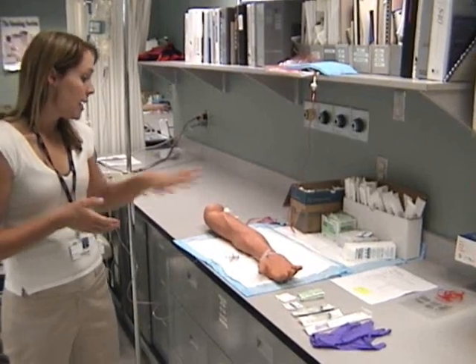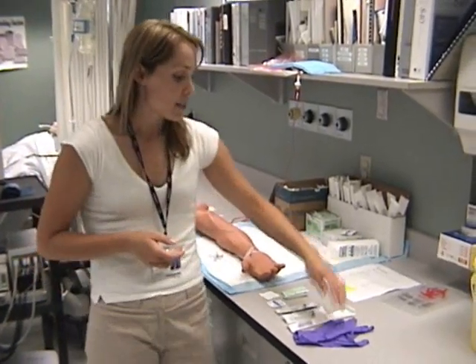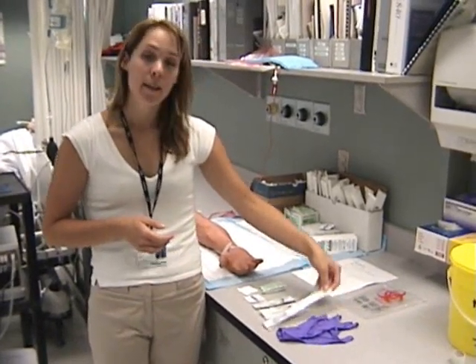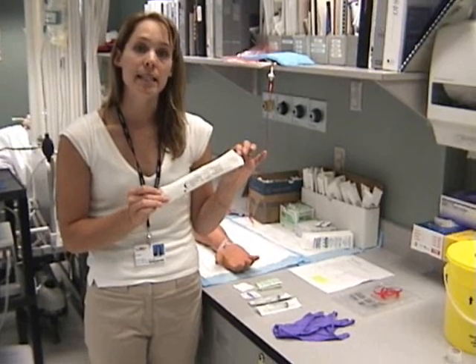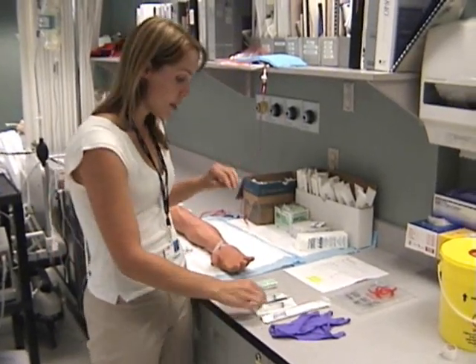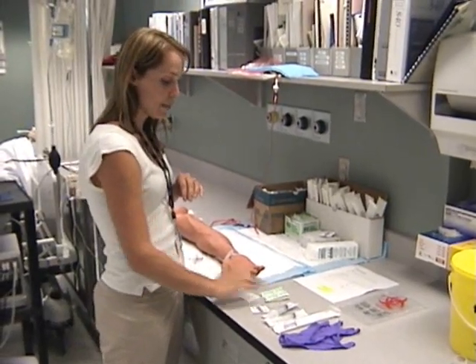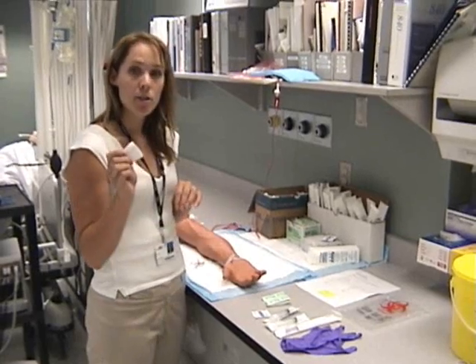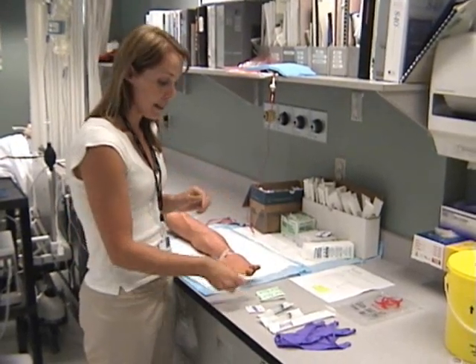The other equipment you want to gather is the blue pad, which we already have under this patient's arm. You want gloves, your biohazard bag, and an arterial blood gas syringe. The ones we're using in this lab are an arterial blood gas kit, so it does have a needle in there that we do not need. You need two syringes, five mils, alcohol, three blunt plastic cannulas, and a piece of gauze to help protect from a little bit of splattering that can occur.